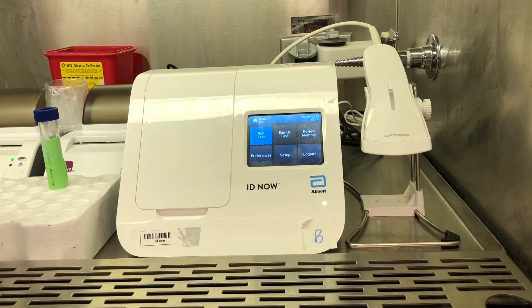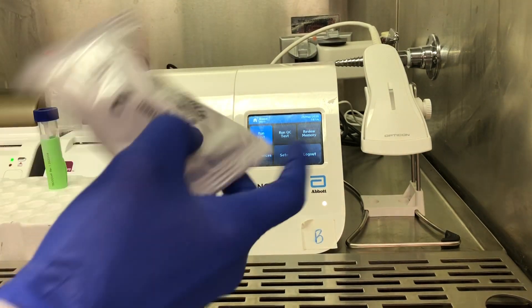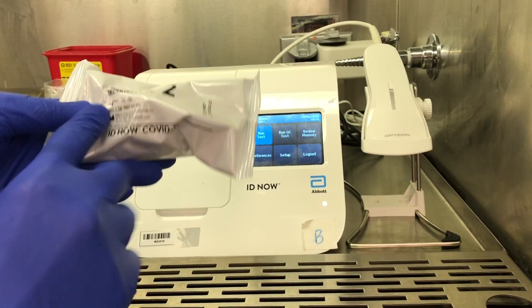In order to run the test, you're going to need package 1, which contains the test base, and package 2, which has the transfer cartridge and sample receiver.